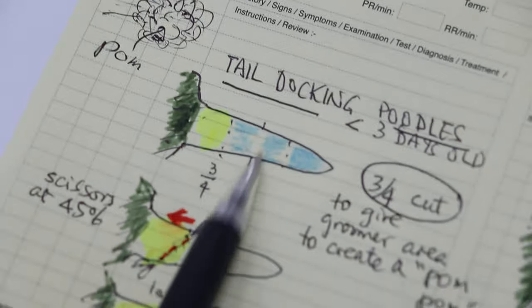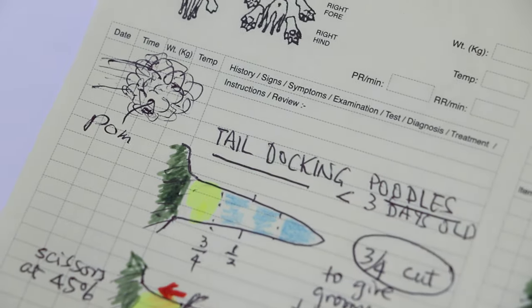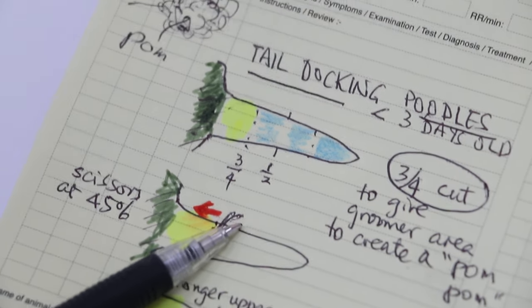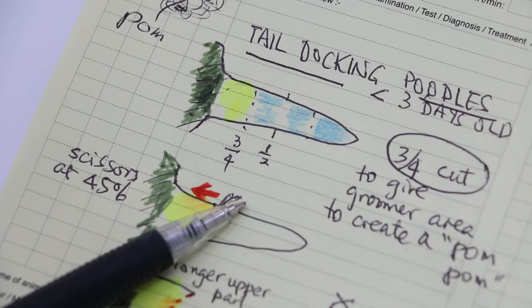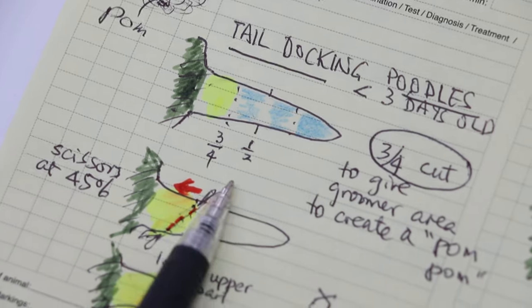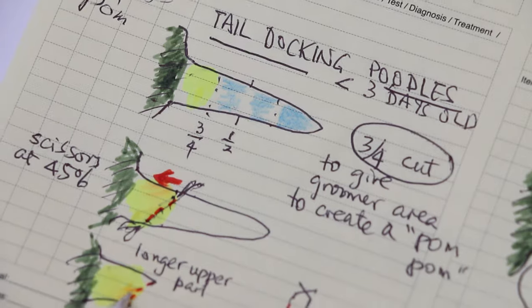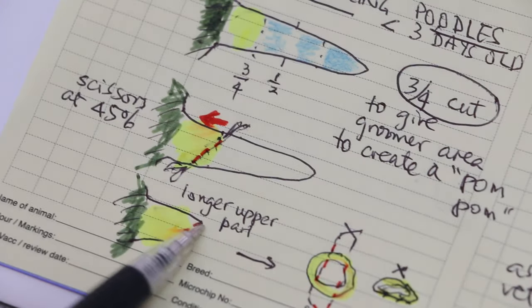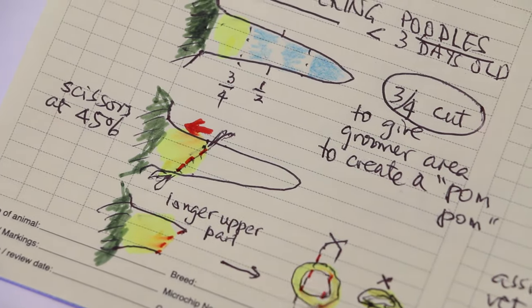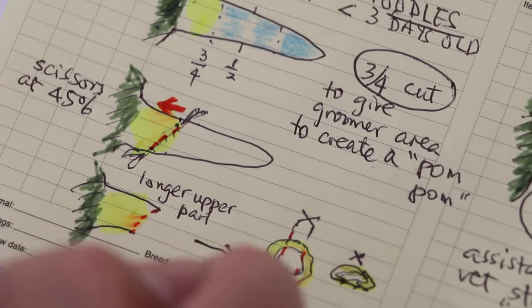For poodles, you measure half, one-quarter, one-quarter, then three-quarter. What you do is use the sterile scissors, place them at 45 degrees, then move the skin inwards. The top part of the skin — move it inwards and you cut. After you cut, you'll find that the upper end is longer. Upper end longer, so you can stitch. You do a cross stitch and close up.